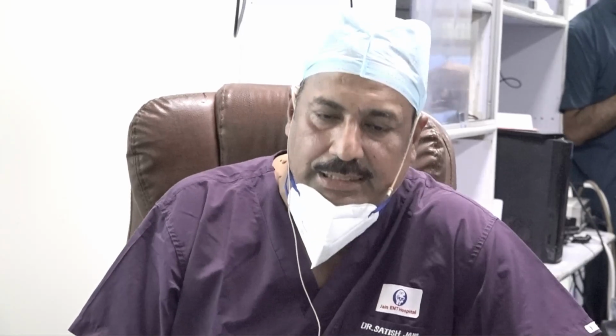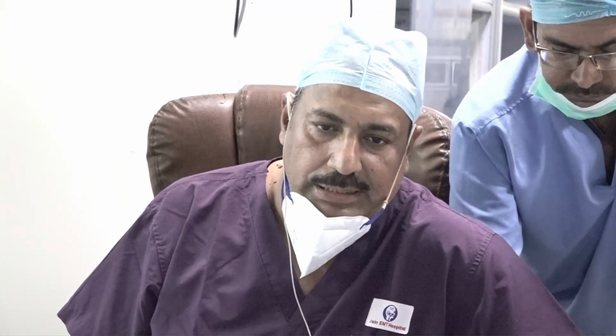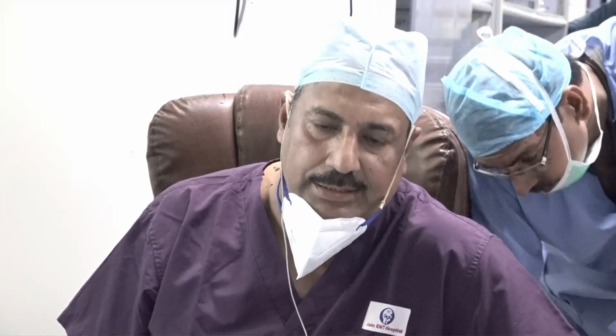If there is any mechanical obstruction, we need to look into the middle ear cleft for any adhesions, any other abnormal situation which requires to be dealt with, the ossicular chain, and we need to confirm that the mastoid air cell system is being aerated down the eustachian tube on the table. If we assess all these three on the table and then graft, we may overcome all those hidden issues which can otherwise result in failure. That's the only thing which we can do to improve our results in tympanoplasty.